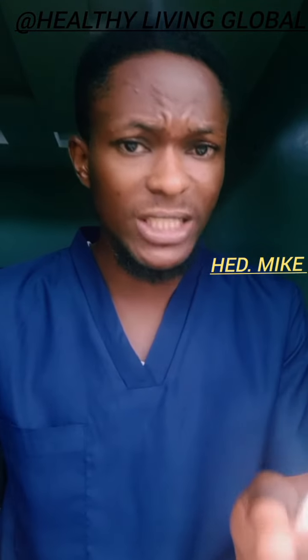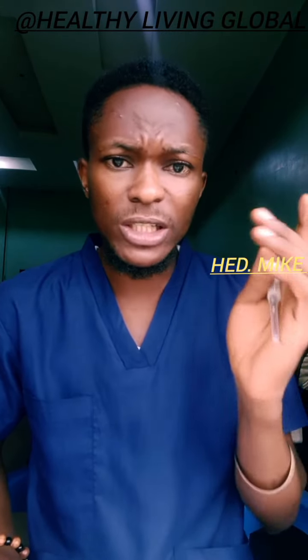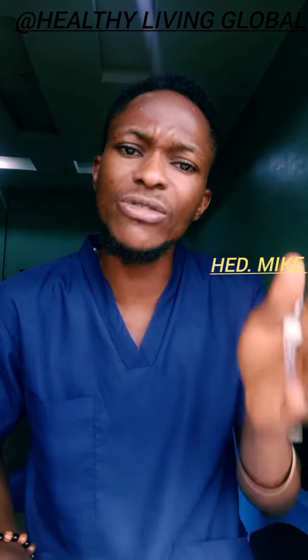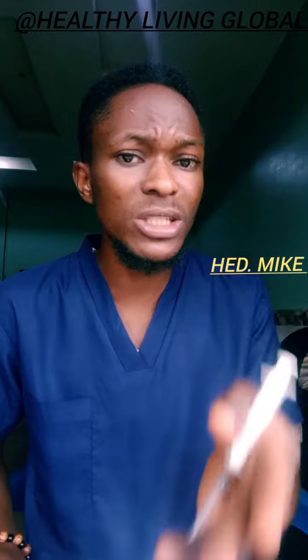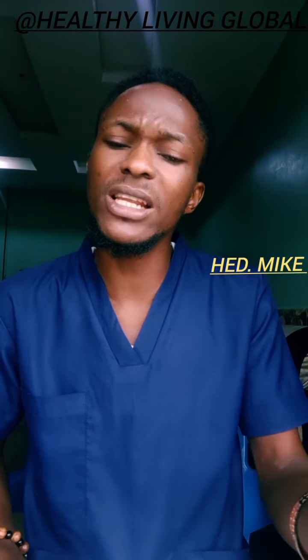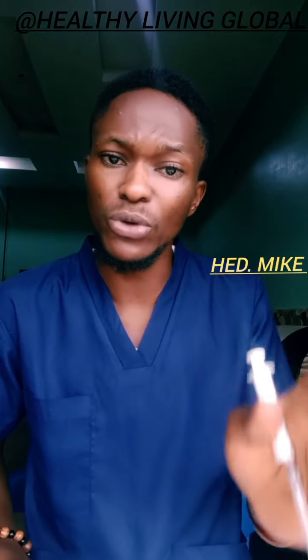Now, what is the goal of someone that is administering injection? The goal is what? To make sure that you give the recommended dose and also give it as prescribed. There are some injections that are supposed to be given very slowly, right? That can take 5 minutes. There are some that take only 1 minute. Read the leaflet or follow the procedure.